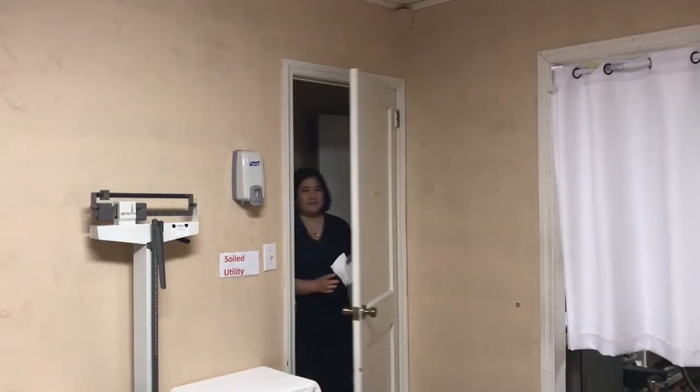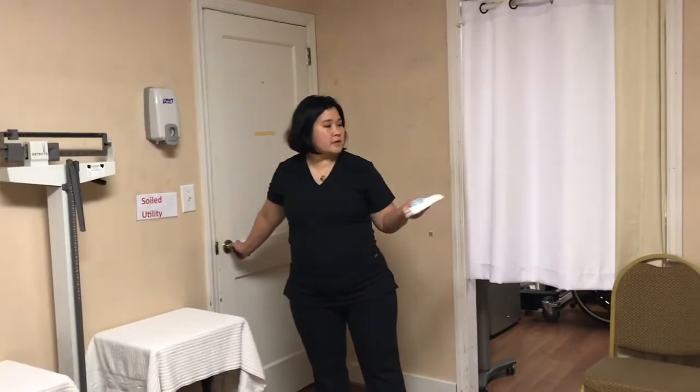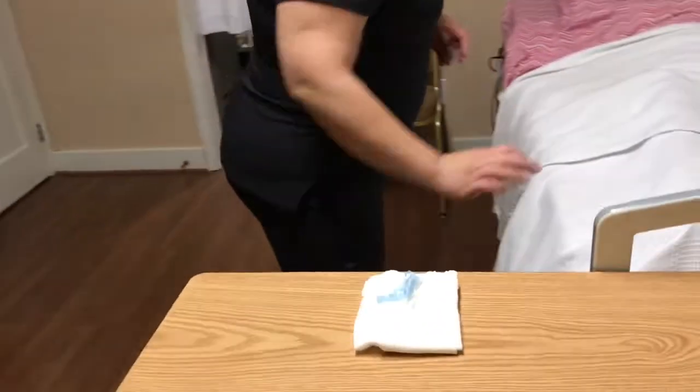Come in. Hello Miss Susie, my name is Tanya. I'm going to be your CNA today. I need to put on your knee-high stockings. First, I need to wash my hands.